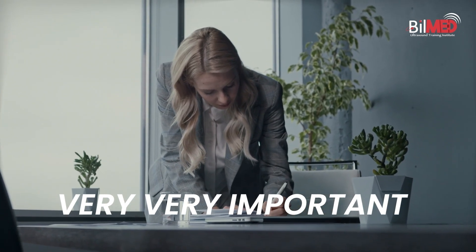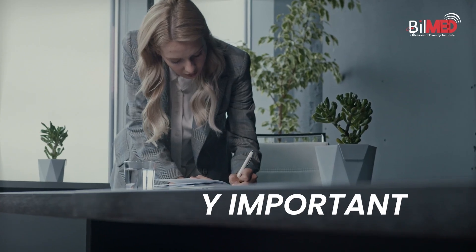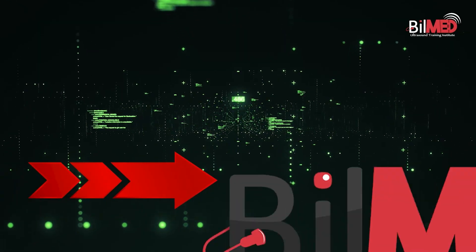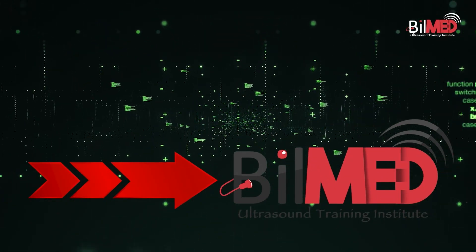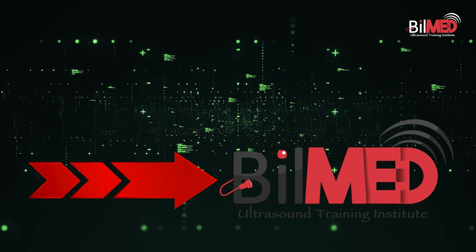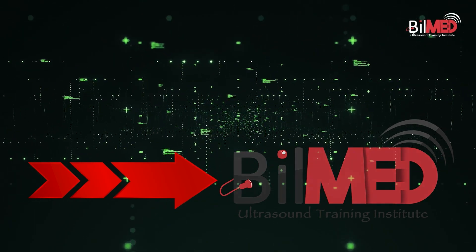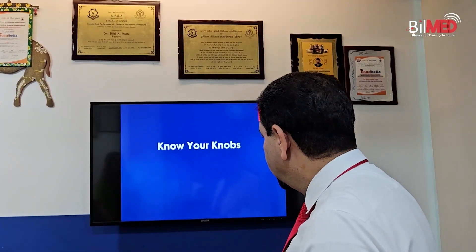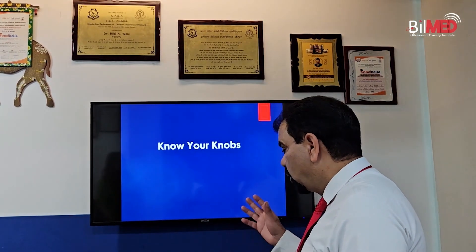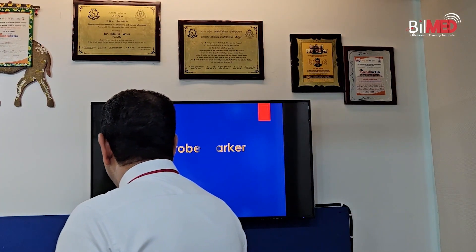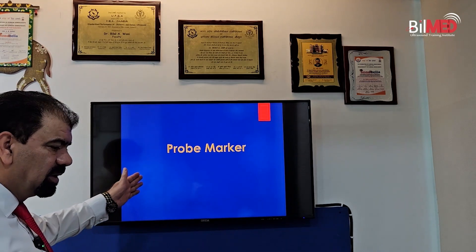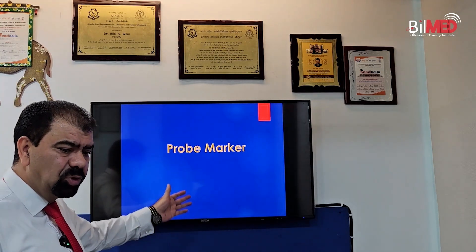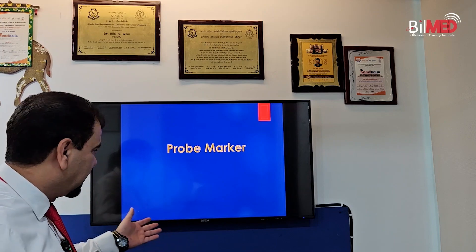This knobology class in detail is available on our server. But today we will take a short demo of the knobology class. Now, know your knobs. But before knobs, there is something which is called a probe marker.